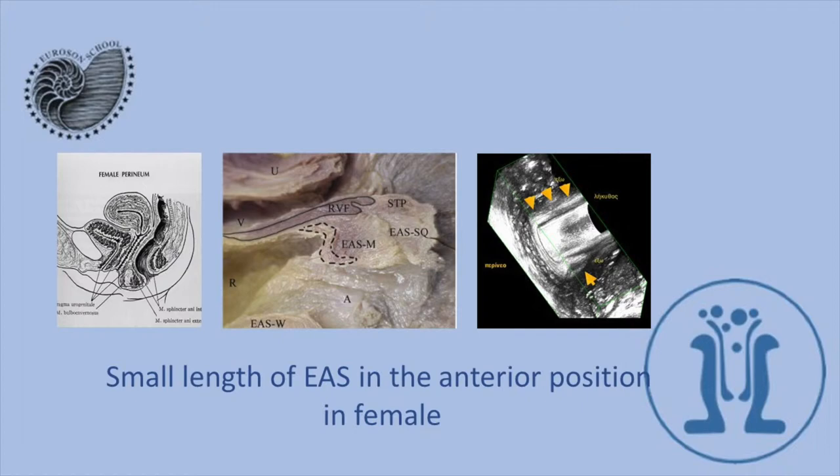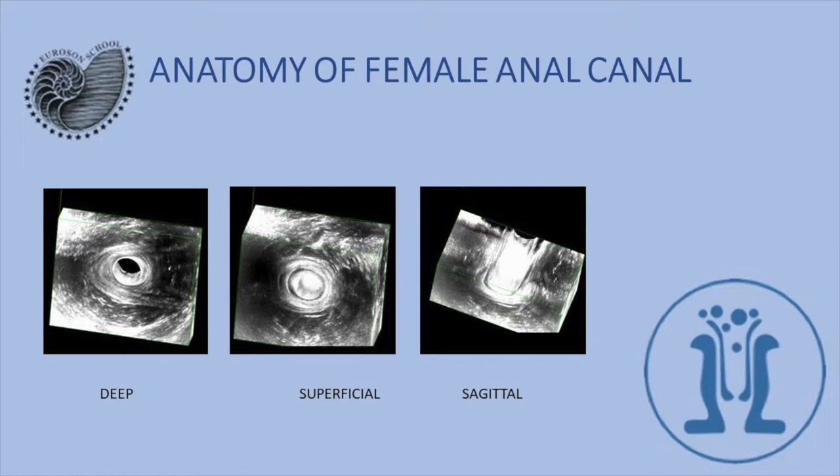Here is the anatomy of the anal sphincter in the deep position. Here is the vagina, and in the superficial position we see that the external sphincter is only at the superficial level. In the deep position there is no external sphincter, and here is the puborectalis muscle. Here we see the sagittal image of the anal sphincters.